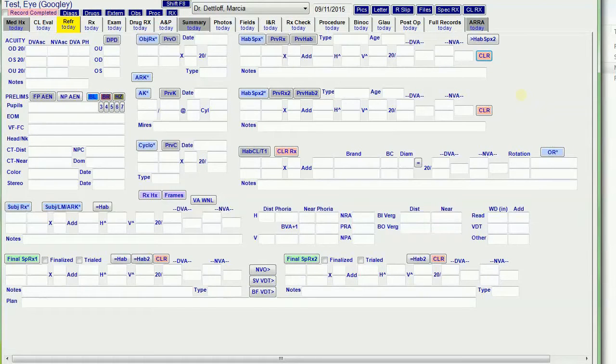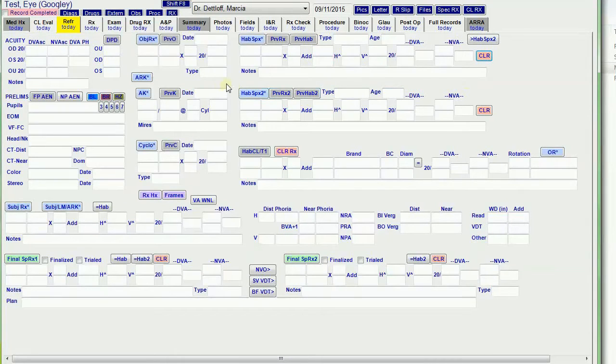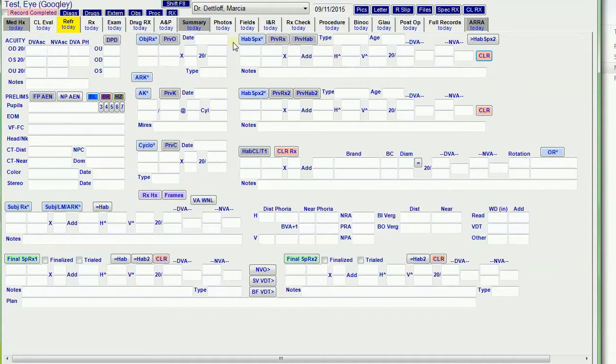So the next one I want to do is the refraction tab. I try to color code my template button somewhat. Blue buttons pull in data from the Marco refraction system. I have a lens meter, AR, AK, and electronic phoropter that can all import data into Crystal.